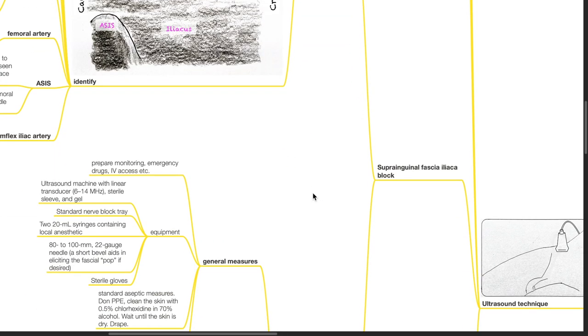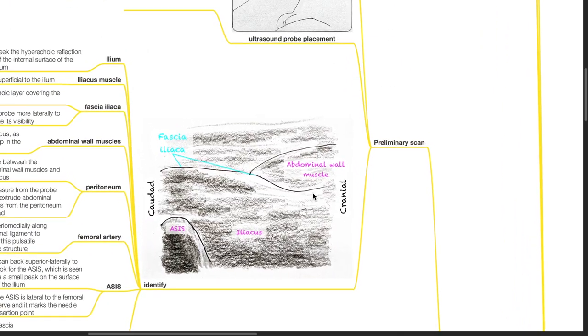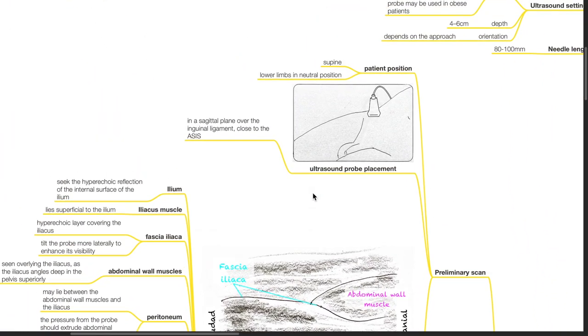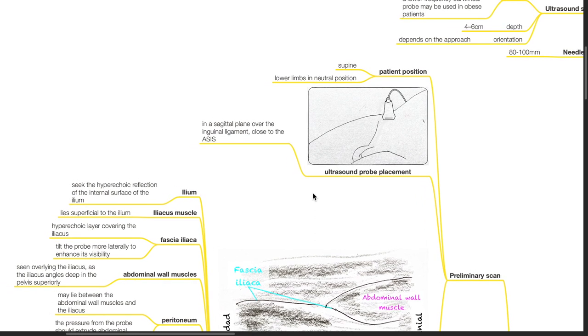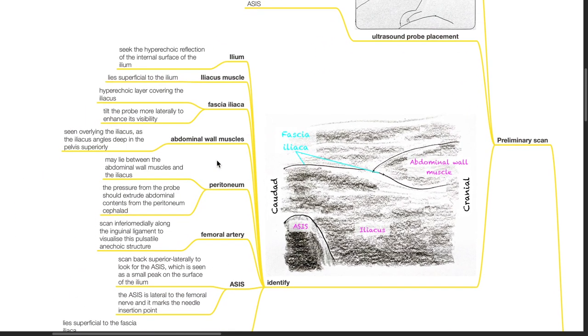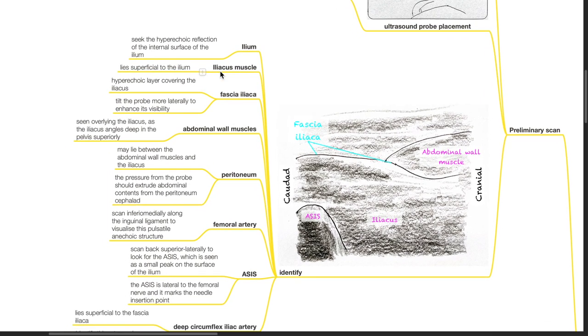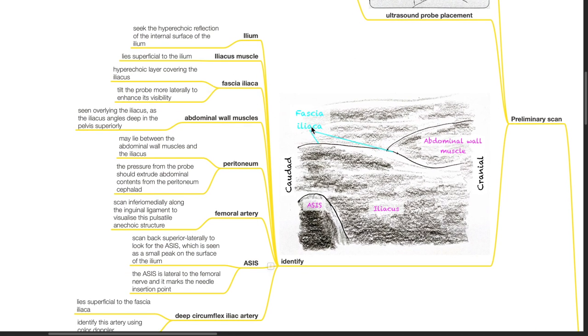Supra-inguinal fascia iliaca block. Preliminary scan. The patient is positioned supine with lower limbs in neutral position. The ultrasound probe is placed in a parasagittal plane over the inguinal ligament close to the ASIS. Identify the ilium. Seek the hyperechoic reflection of the internal surface of the ilium. Identify the iliacus, which lies superficial to the ilium. The fascia iliaca is seen as a hyperechoic layer covering the iliacus.